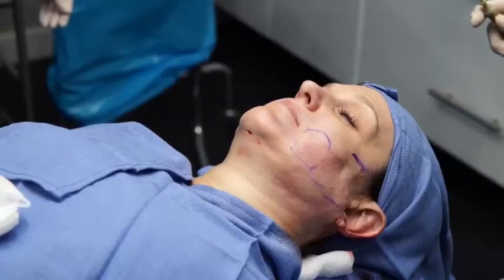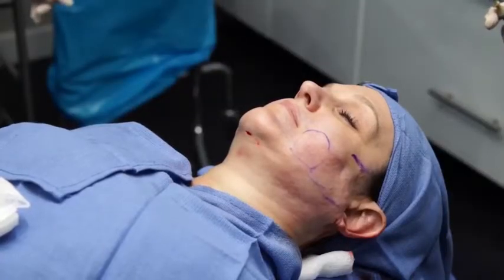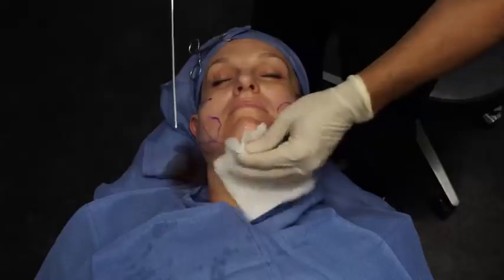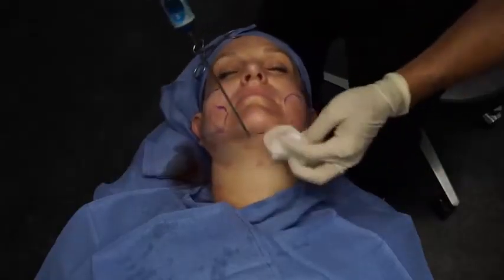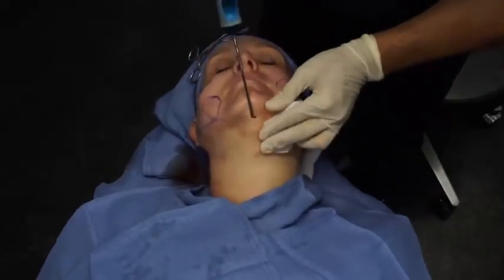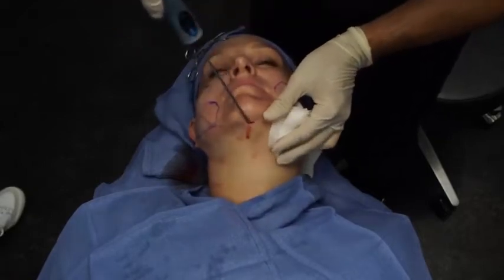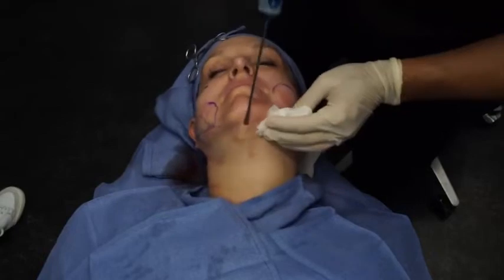Okay, now we're going to pre-dissect. We can pre-dissect with blunt instruments, with ultrasound instruments, laser instruments, but not with the Renuvion cannula. Many different cannulas can be used for dissection. Chin way up for me, hon. Here we're going to use a spatulated cannula, and you'll just use the spatulated cannula to create your dissection plane in preparation for your Renuvion treatment.